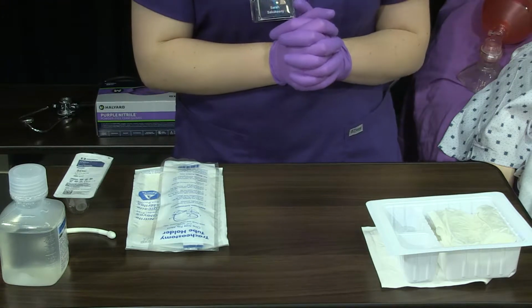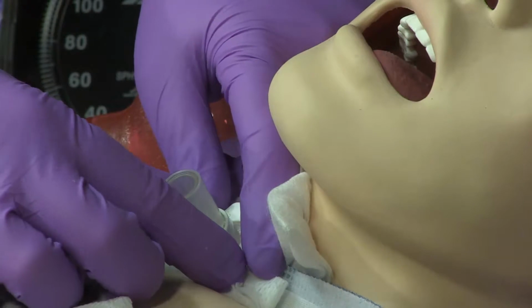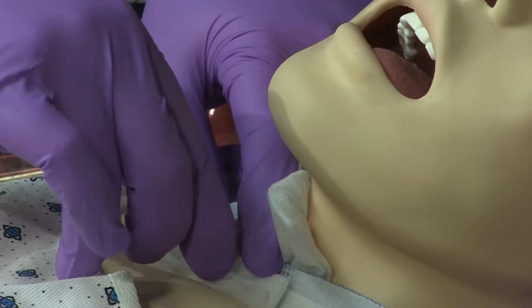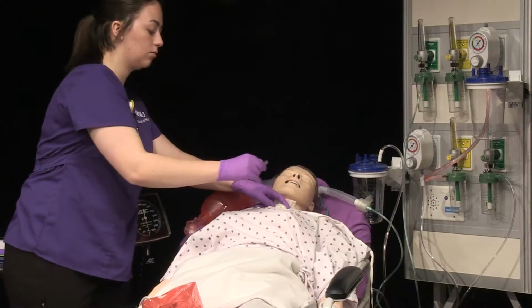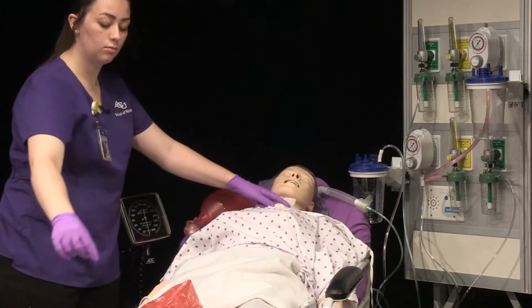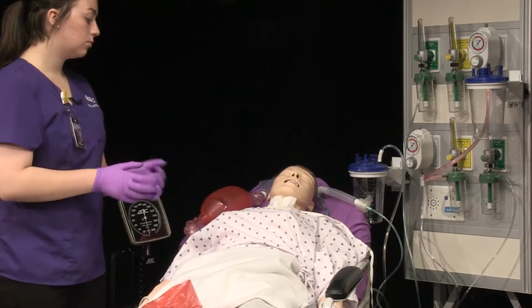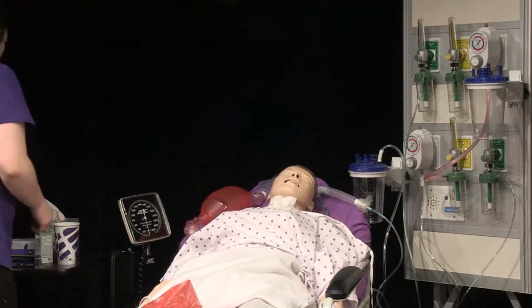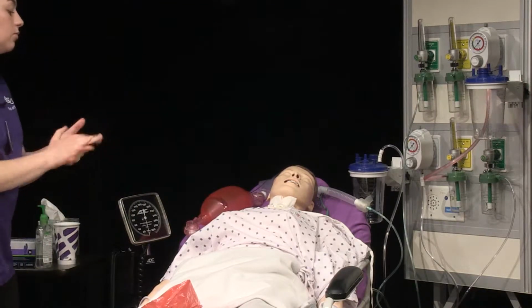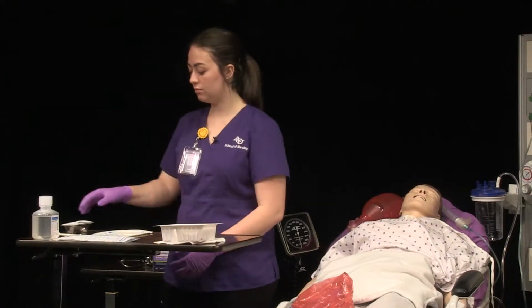Remove inner cannula. Alright, I'm just going to remove the inner cannula. Stabilize faceplate with one hand. Twist inner cannula to unlock it. Pull the inner cannula up and out and dispose of inner cannula per facility policy. Remove and dispose of gloves and perform hand hygiene. Prepare remainder of supplies from kit.